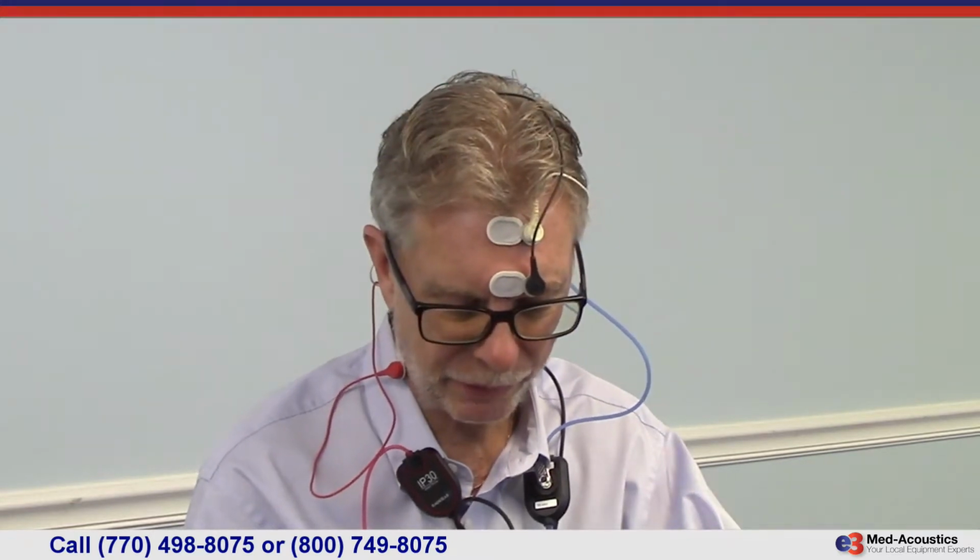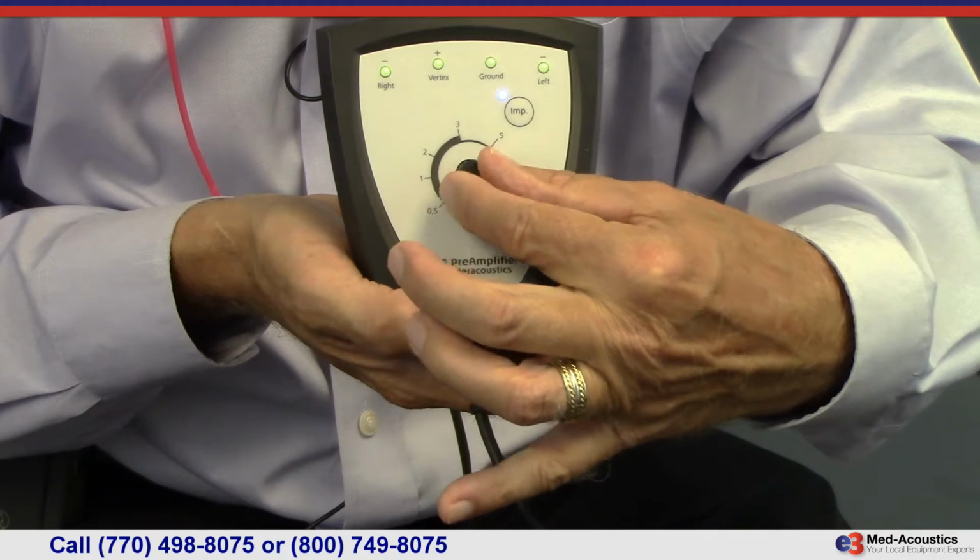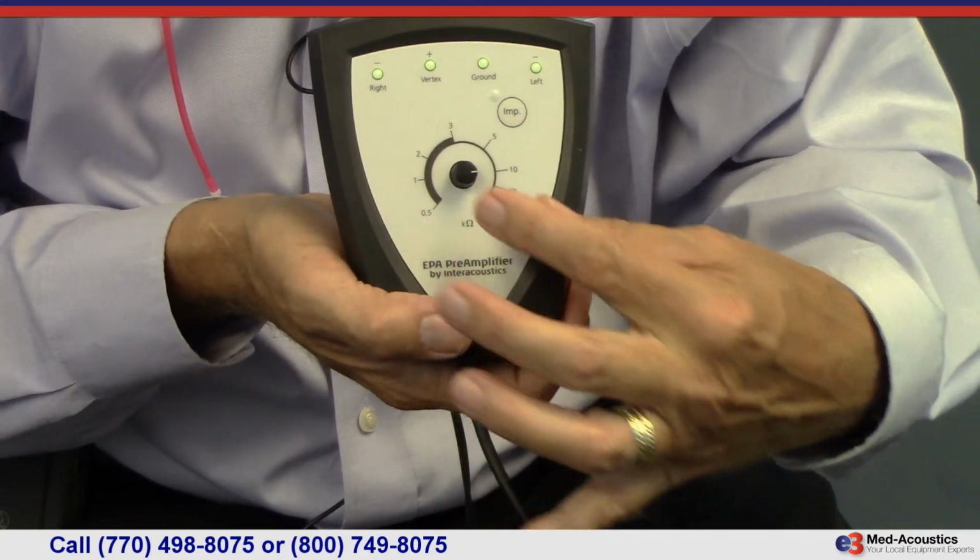So that means that the impedance is either 3K or less, and that would be recommended. If I were to go any higher, I'd go to 5, and some people even go to 10, but 3 is what's recommended. The better the impedance is, the better the response is, the better the signal-to-noise ratio is, the better the common mode rejection is, just better for everything. So that's something that we should be always concerned with.